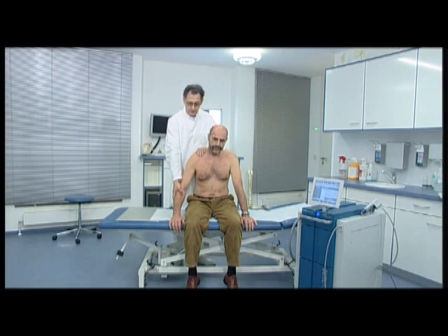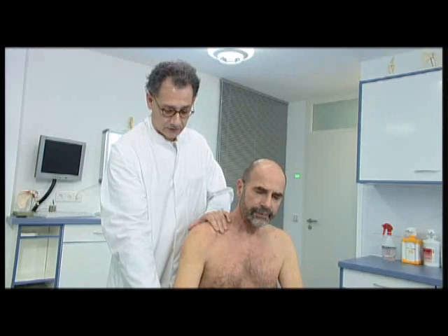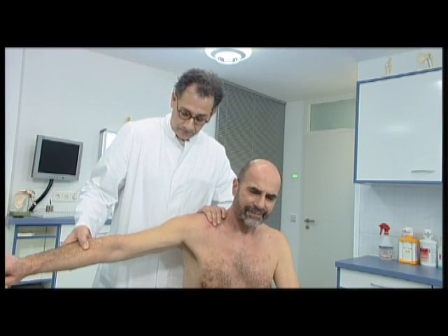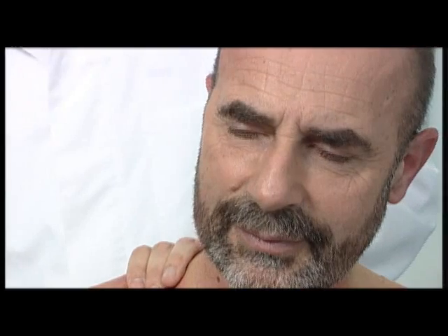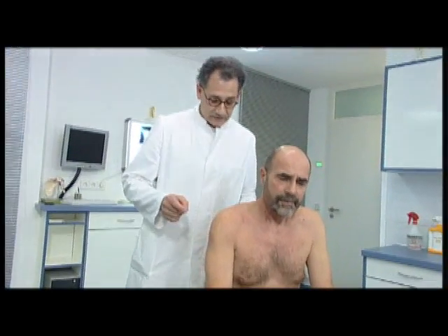Bitte den Arm nach vorne anheben. Chronic shoulder pain is the most well-known indication for orthopedic shockwave therapy. Nochmal zur Seite, bitte. This condition typically causes referred pain, which manifests itself by a substantially reduced mobility of the shoulder-arm region. Wir suchen jetzt den Schmerzpunkt.